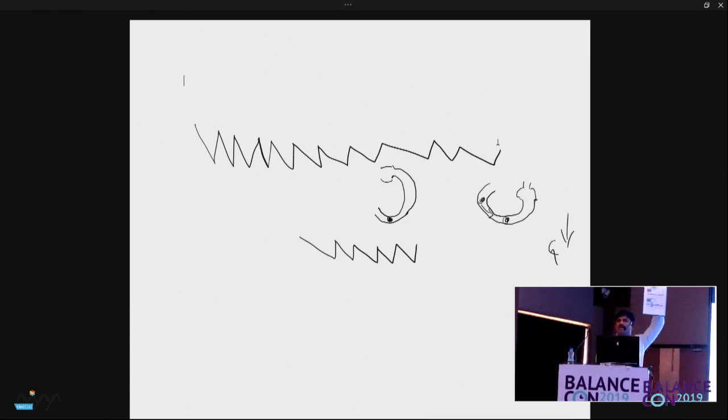By what we saw from looking at it on turning to the right, we expected a right beating nystagmus or no? Yes. We expected the eye to move slowly to the left and beat to the right. Correct? Now let us see what happens next.